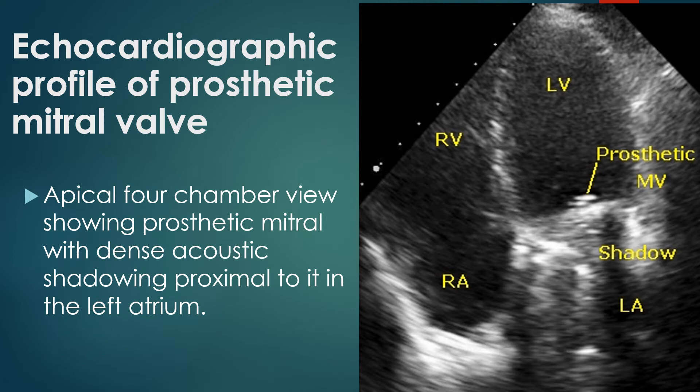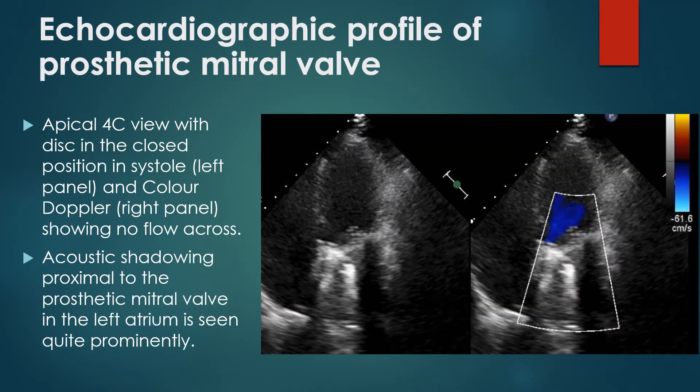The apical 4-chamber view shows the prosthetic mitral valve with dense acoustic shadowing proximally in the left atrium. The prosthetic mitral disc in the closed position in systole is seen in the left panel, and the colour Doppler image in the right panel shows no flow across the mitral valve. The blue colour in the left ventricle is the left ventricular outflow, which is directed away from the apical transducer and hence coded blue. Acoustic shadowing proximal to the prosthetic mitral valve in the left atrium is seen quite prominently.